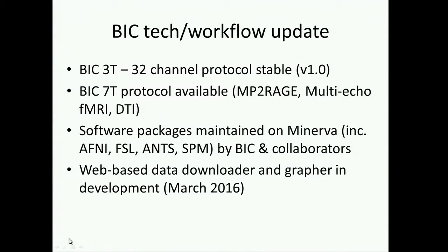Right, so just a quick update between the activities of the BIC Tech Meeting Committee and the BIC workflow. We've standardized the BIC 3T protocol. Our workhorse now is the 32-channel protocol. The field maps, anatomical, functional, and DTI have now been bug tested for a year.